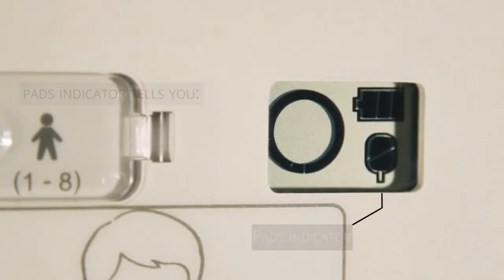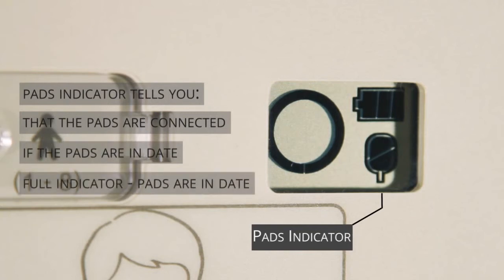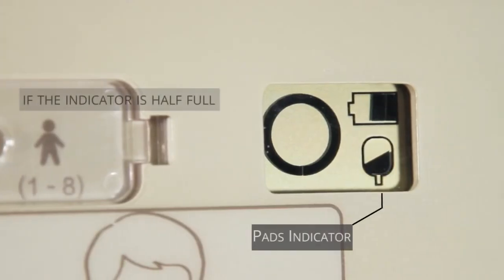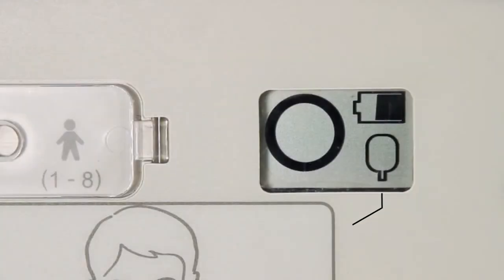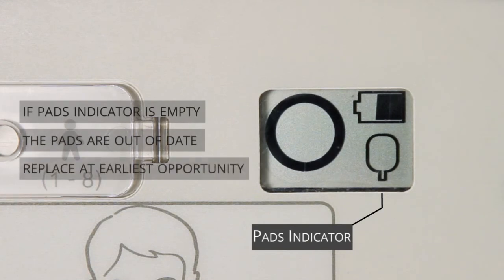When the battery indicator changes from one bar to no bars, the battery should be replaced at the earliest opportunity. Thirdly, the pads indicator tells you that the pads are connected to the AED and whether they are in date. If the pads indicator is full, the pads are in date. If the pads indicator is showing as half full, the pads will expire within three months and new pads should be ordered. If the pads indicator is empty, the pads are out of date and should be replaced at the earliest opportunity.